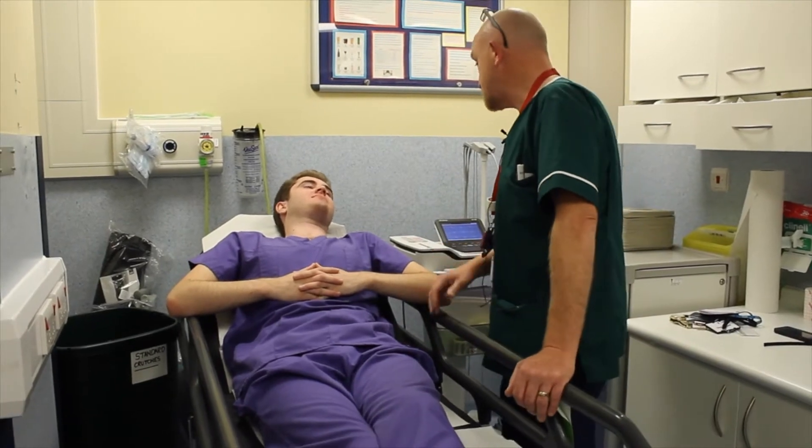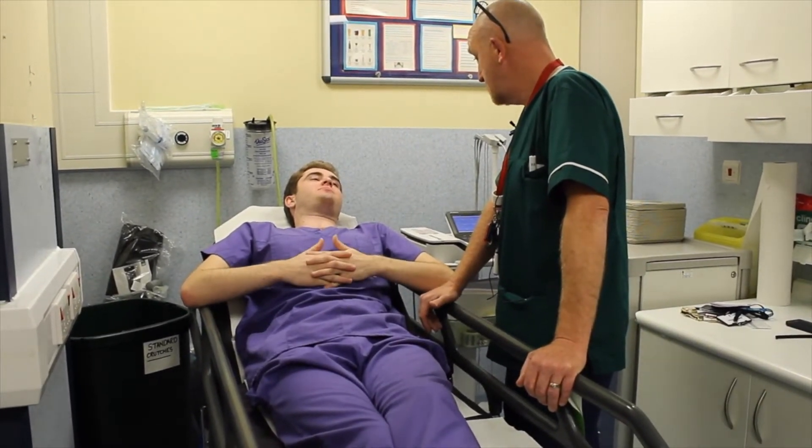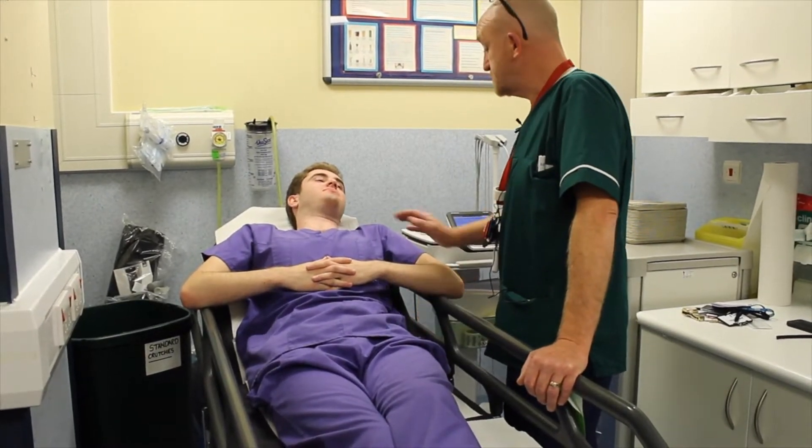Okay Jack, my name is Rich. We need to perform an ECG. I know — is that okay? Yeah. Have you had one done before? Yeah. Okay, let's see what we're going to do then.